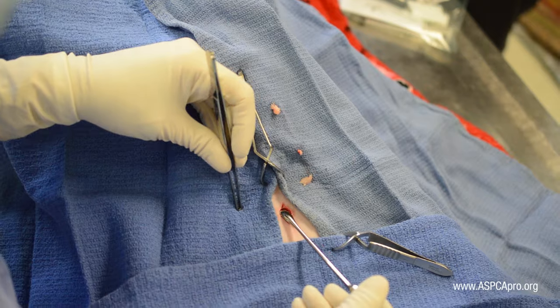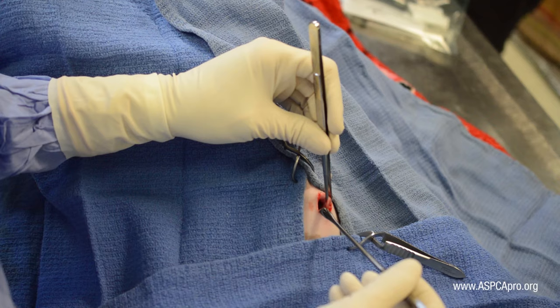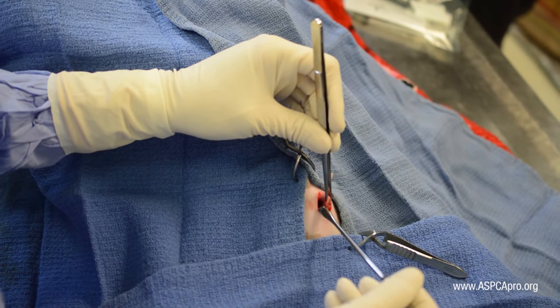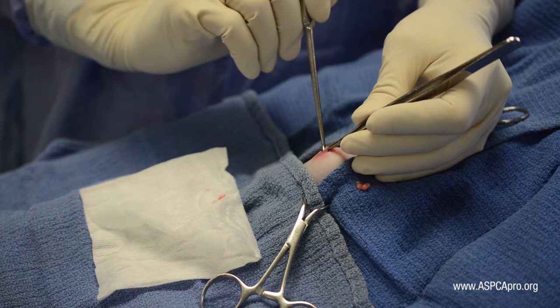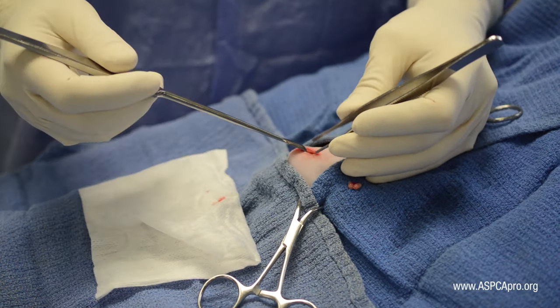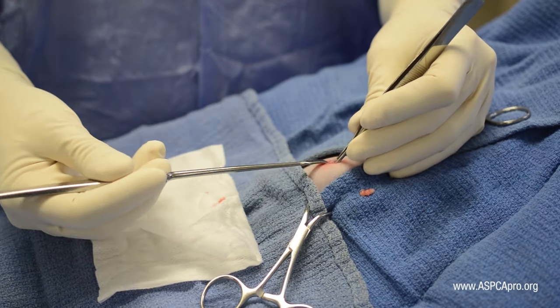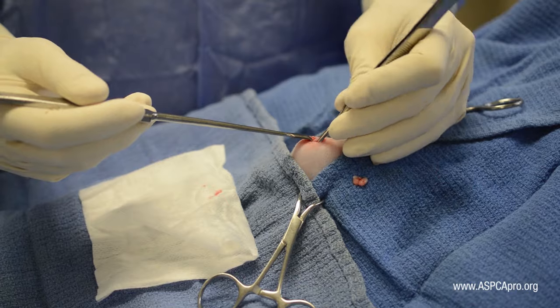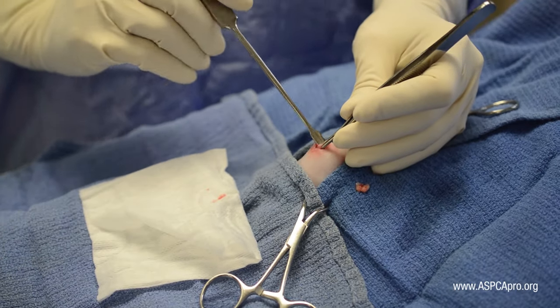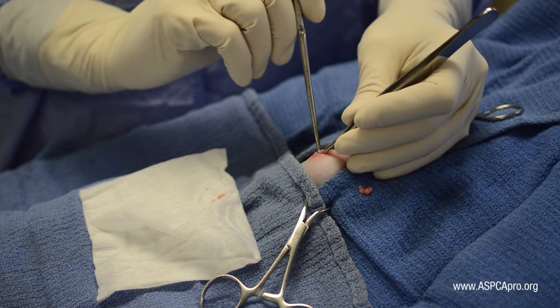The next step is using thumb forceps to grasp the body wall. Whichever side the surgeon chooses to attempt location of the uterus is the side of the incision that will be held. An easy way to grasp body wall without accidentally grasping underlying tissues is to insert the spay hook in the caudal edge of the incision and apply caudal and upward traction. This will pull the body wall away from the omentum and other abdominal organs, so that only the body wall is obtained.